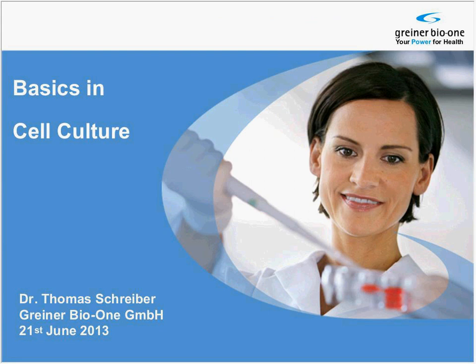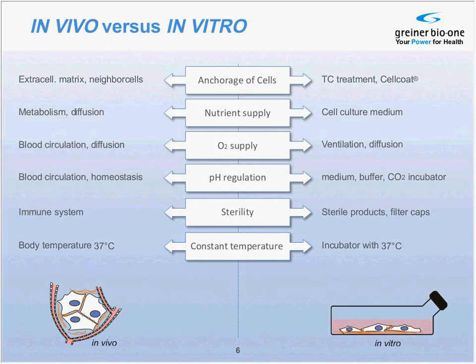Thank you for the kind introduction, and welcome to today's webinar on basics in cell culture. Cell culture is one of the most important techniques in biomedical research and biotechnology. When human or animal cells are isolated from primary tissue, they can be maintained with proper conditions in culture. To fulfill this, all the conditions that apply in vivo, such as the extracellular matrix of the cells or neighboring cells, metabolism, blood circulation, homeostasis, immune system, or body temperature, have to be transferred to the condition in vitro.